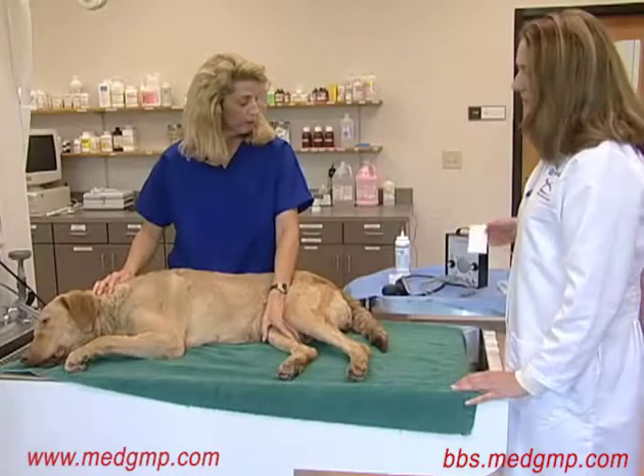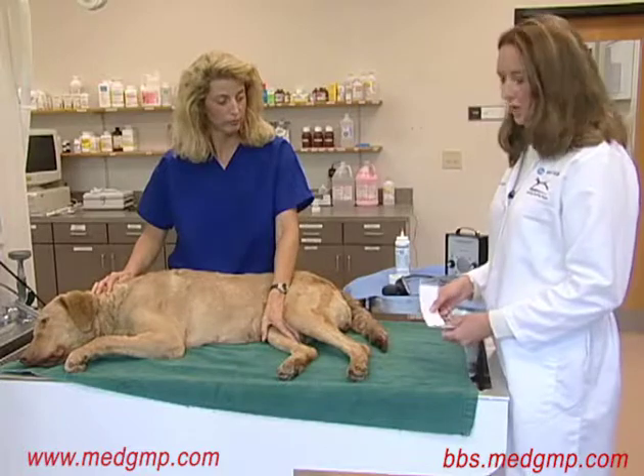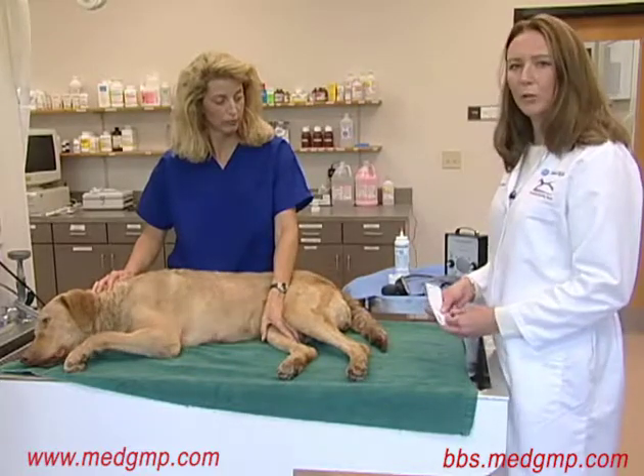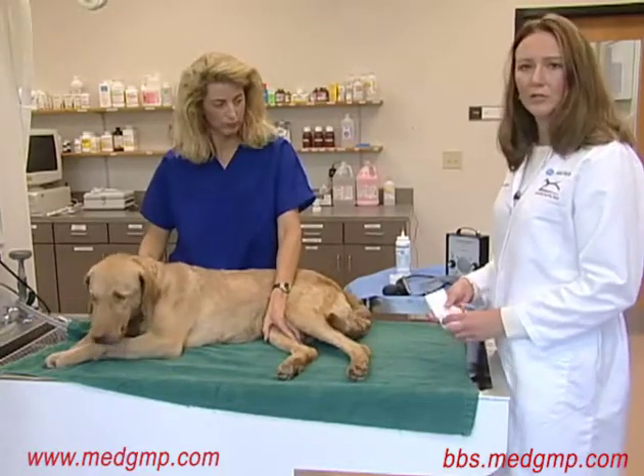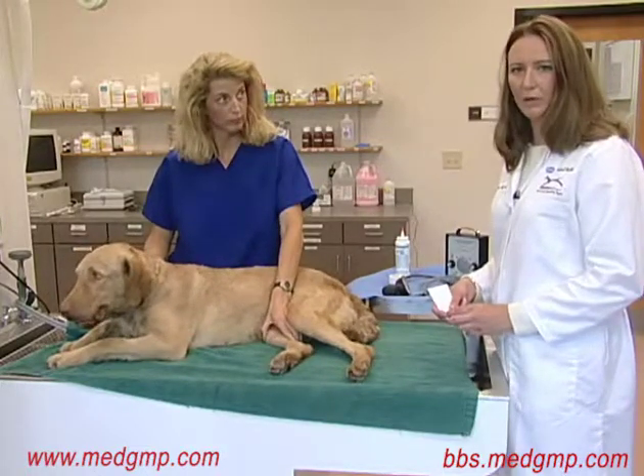All blood pressure measurements using indirect methods require the placement of a cuff. Using the correct size cuff is very important. If you use too large a cuff, you'll underestimate the blood pressure. If you use too small a cuff, you'll overestimate the blood pressure.